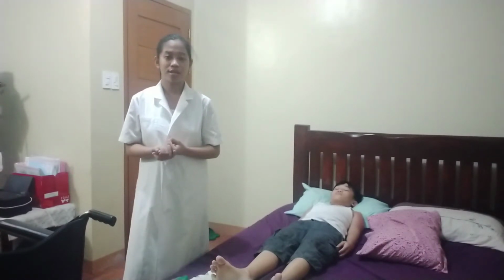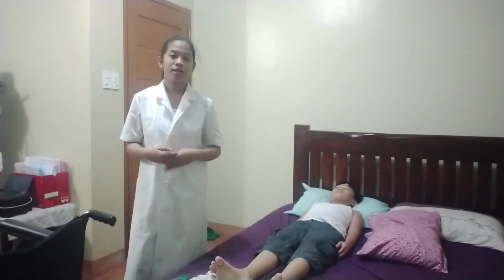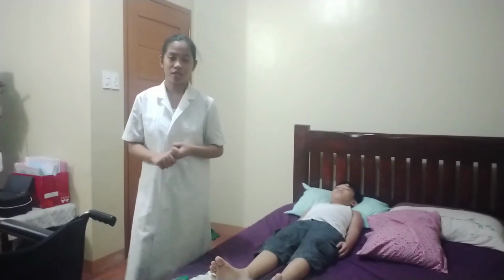Usually, we need equipment like a chair or a wheelchair, a gait belt, the stand assist device if available, and based on the assessment, an additional nurse or staff to assist if it is available. Depending on the patient's condition, a blanket and non-sterile gloves or other PPE if it is indicated and necessary.